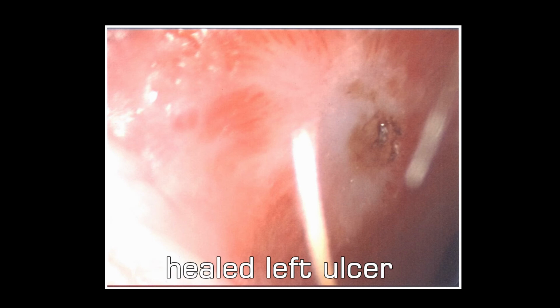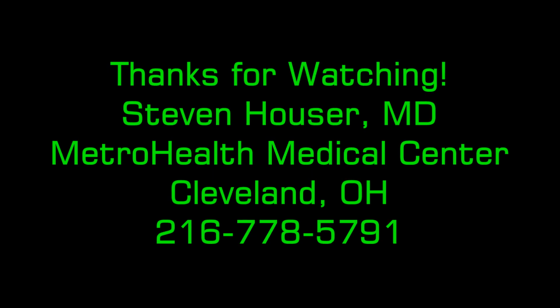And here we see a different patient, approximately 3 months after surgery, and for the most part pretty well healed on their left side. The mucosa is white, pale, but actually functional, with very minimal crusting. An improvement. Thank you.